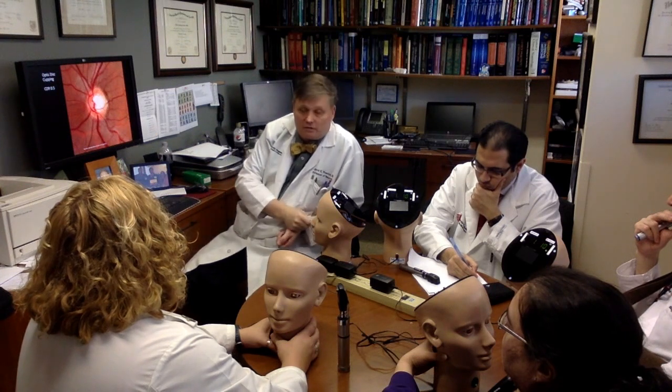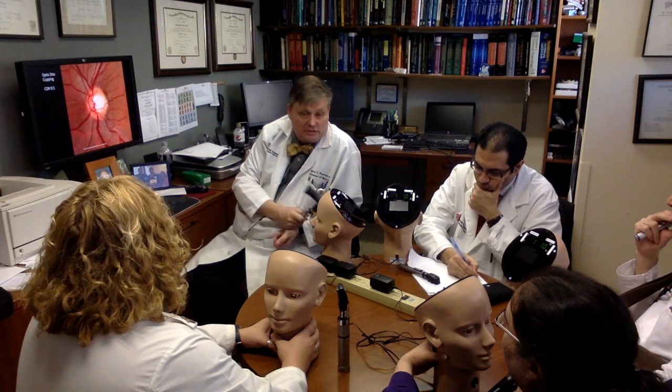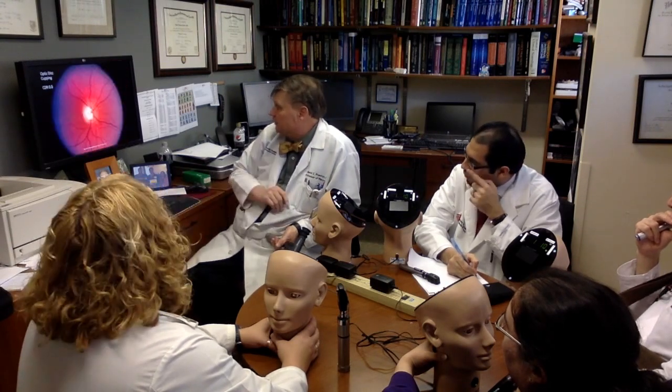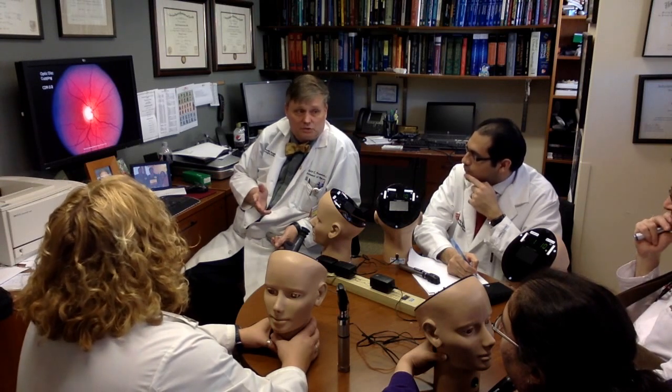Compared to the whole thing, this is a half. Now, you might say up to a half might be considered normal, but this you would definitely want the ophthalmologist to measure the intraocular pressure. Can glaucoma cause headaches? Yes. Sure, absolutely. Now, let's look at this one. Look at this cup to disc ratio. This person may have no symptoms.